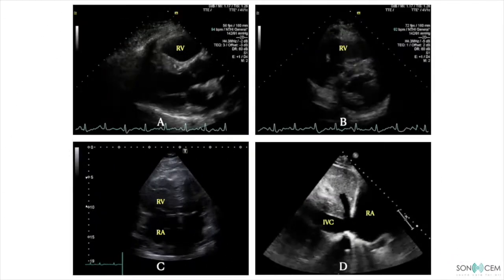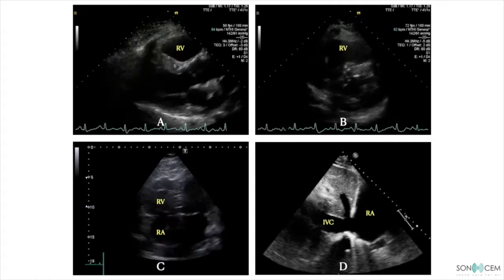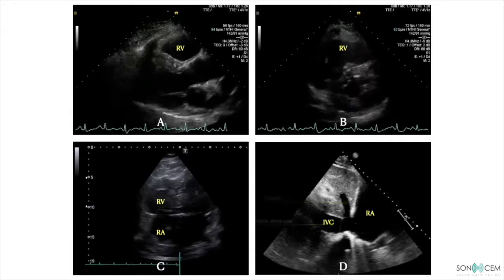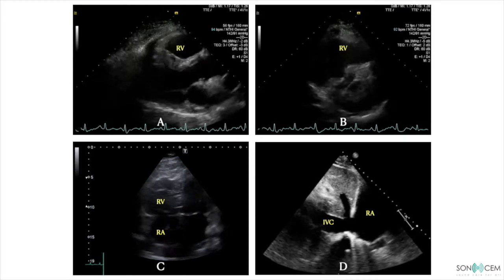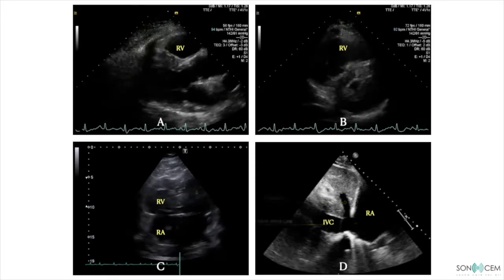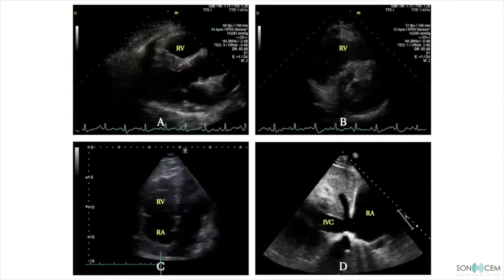These clips show RV strain pattern where the RV is dilated, as you can see in clip A. The RV ratio to the ascending aorta and LA is more than 1. In clip B, you can see the evidence of increased pressure in the RV as the interventricular septum is being pushed toward the LV.